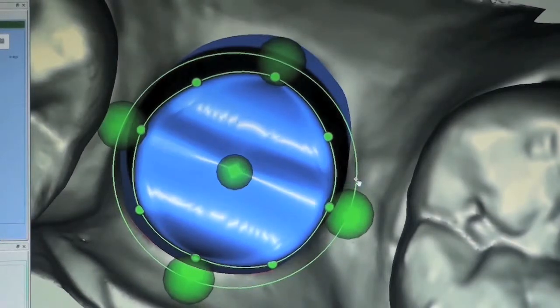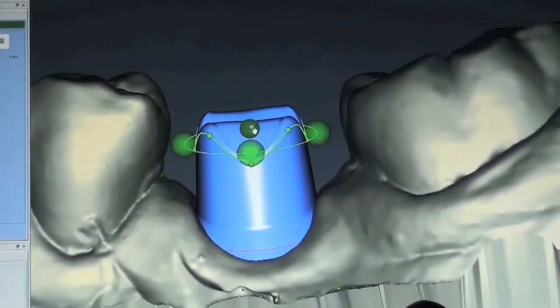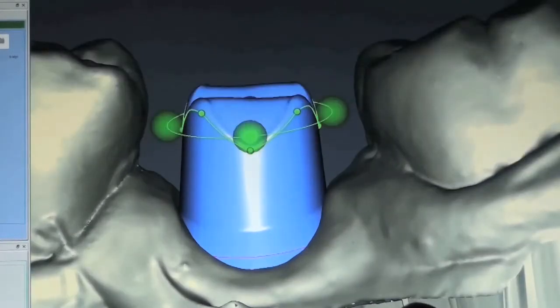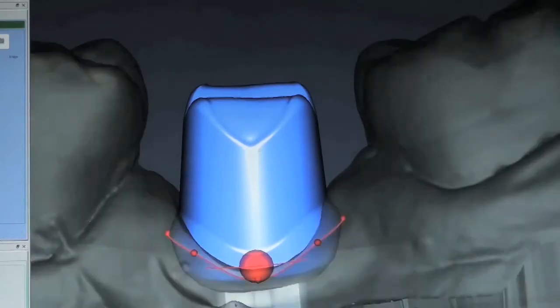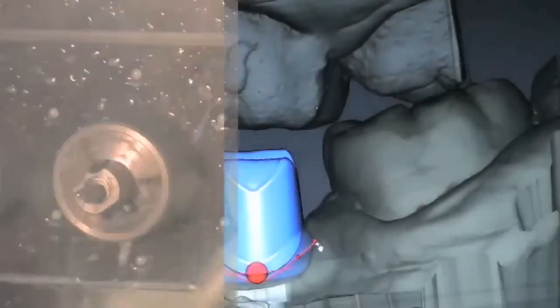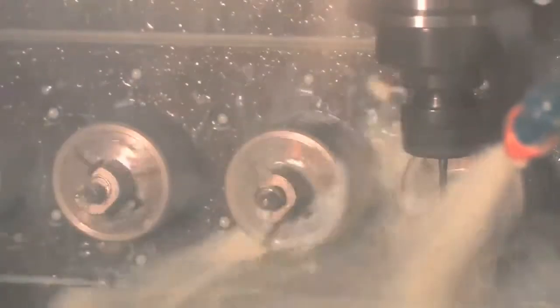Glidewell can provide a custom abutment at about the same price as you would pay for an off-the-shelf abutment from the implant manufacturers. Here you can see the 3Shape Abutment Designer program being utilized to virtually create the custom abutment. This software allows the technician to correct angles, adjust the overall height, as well as set the margin below the gingival contours. Once the design is completed, the custom abutment is milled and the PFM restoration fabricated.